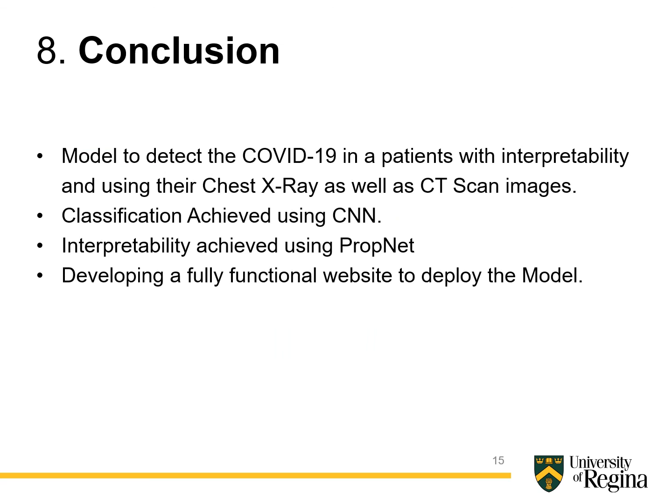As mentioned before, detecting COVID-19 in a patient in a timely manner is very crucial. The current technologies, like tests conducted using test kits such as RT-PCR, are not that reliable, and are expensive and time consuming. So we have come up with a solution of using chest X-ray and CT scan images to classify whether the patient has COVID-19 or not. We are also taking into account normal, viral pneumonia and COVID-19 cases, and we achieve this using a CNN algorithm, which is a convolutional neural network.